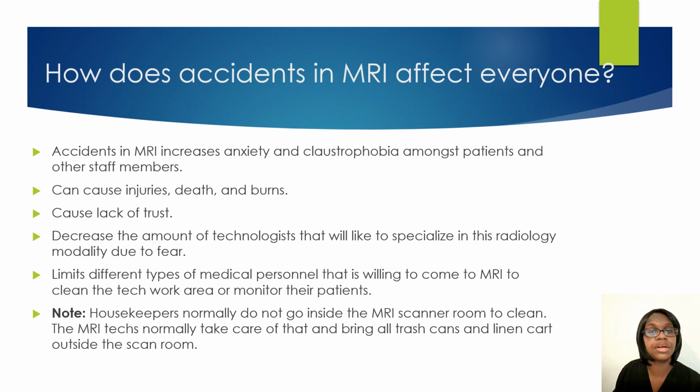Whenever accidents occur in MRI, it affects everyone. It increases anxiety, claustrophobia. It can cause injuries, death, or burns. It causes lack of trust. It decreases the amount of technologists that will likely specialize in MRI due to fear. It limits different types of medical personnel that is willing to come to MRI to clean the tech work area or to monitor their patients.